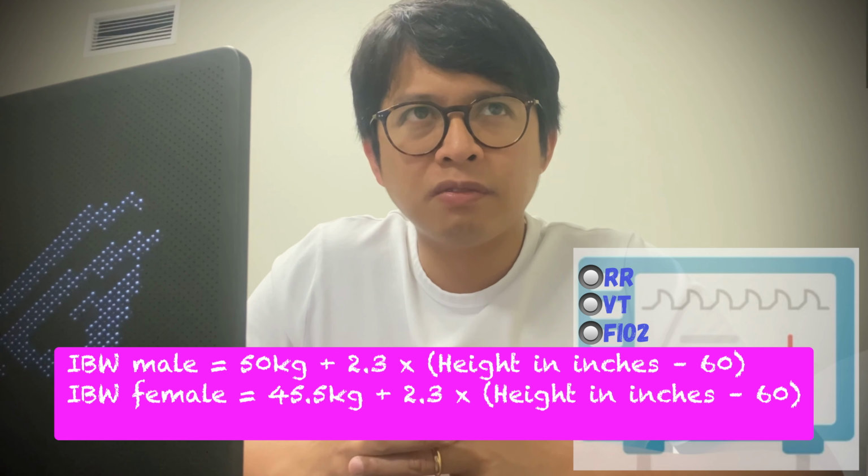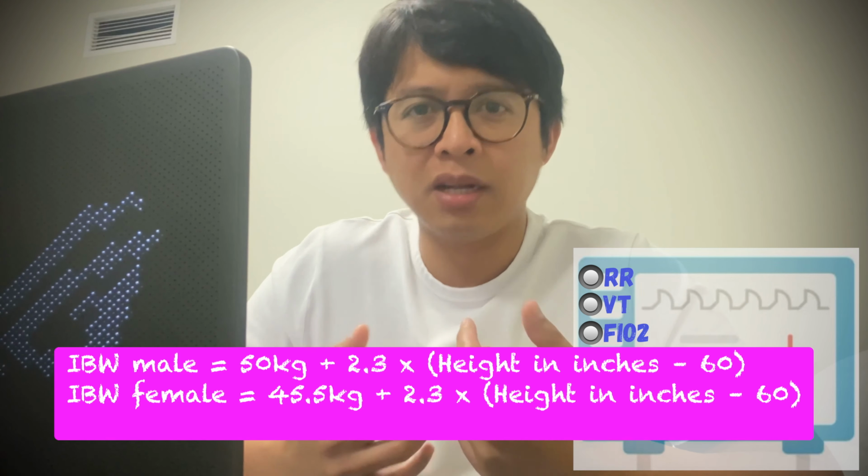How about tidal volume? How do we set the tidal volume? A safe tidal volume can be determined based on the patient's height, gender, and ideal body weight. It ranges from 6 to 8 ml per kg of ideal body weight. That is around 500 ml in an average healthy adult male and approximately 400 ml in a healthy female. This is the formula, as you can see on the screen. This is how to get the safe tidal volume.